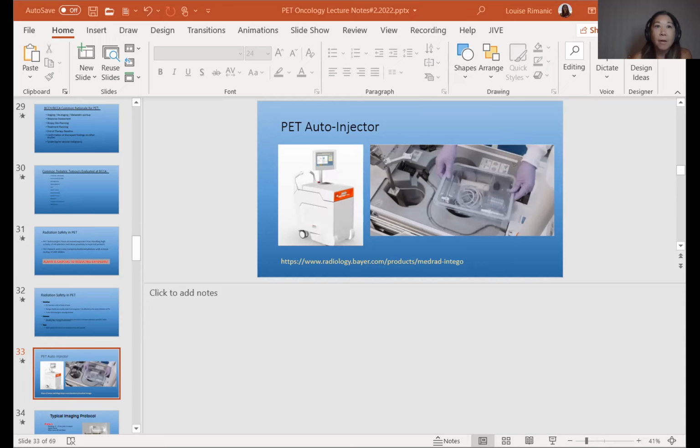Just to note that brown fat is also known as USA fat, and that's not a slur on the Americans being overweight. It stands for uptake in the supraclavicular area. Okay, so USA fat or brown fat, referring to the same phenomenon. So again, more physiologic uptake of brown fat, right?